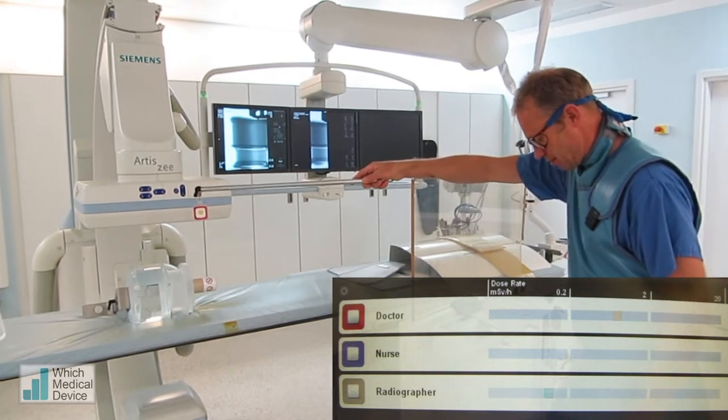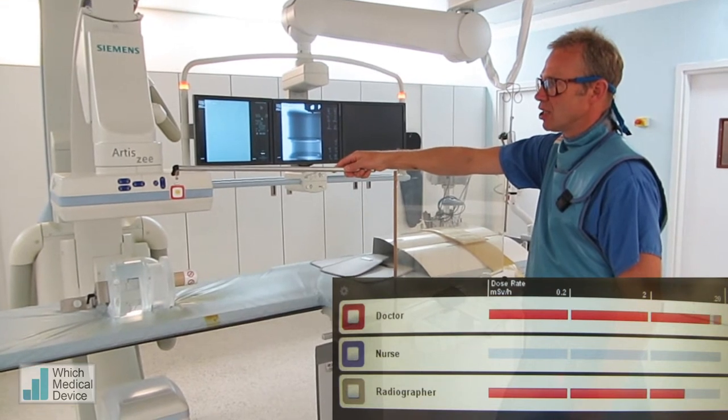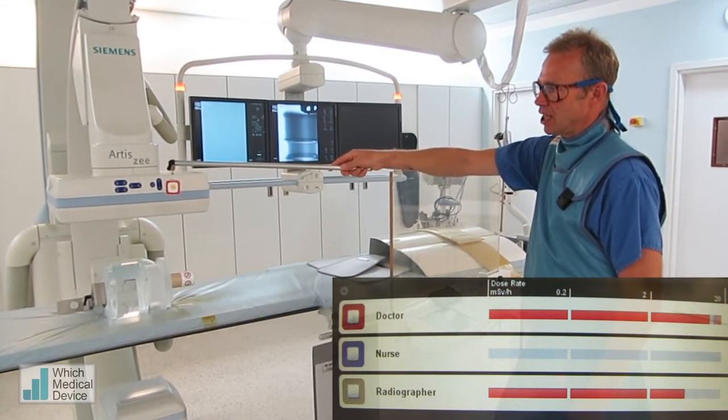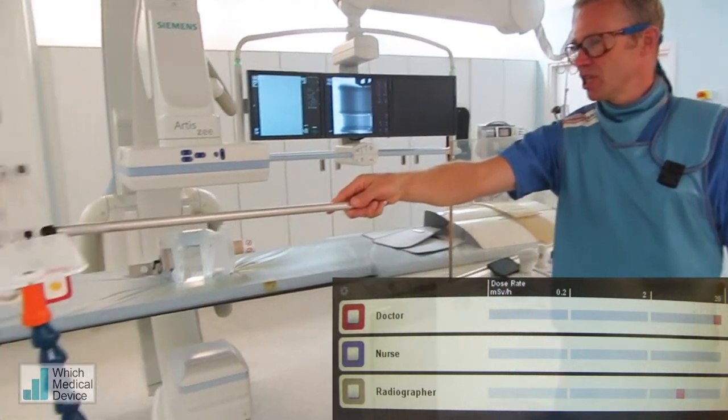I'm just going to stand behind the screen. And we're right up into the red, both for the metre I'm holding here and also for the metre that's over here, which is a little bit further away.